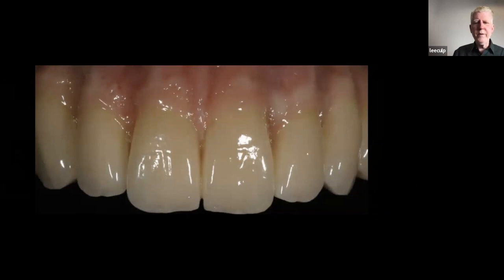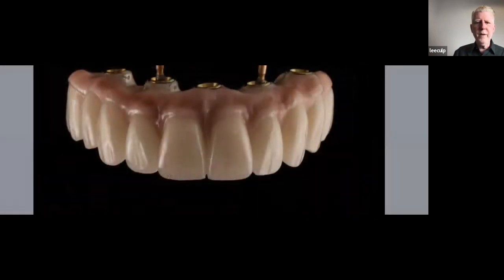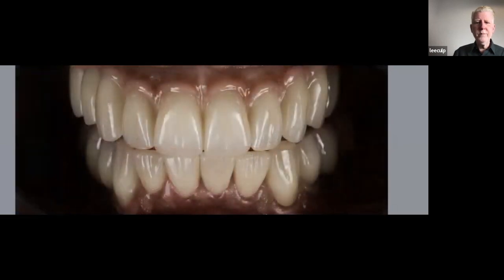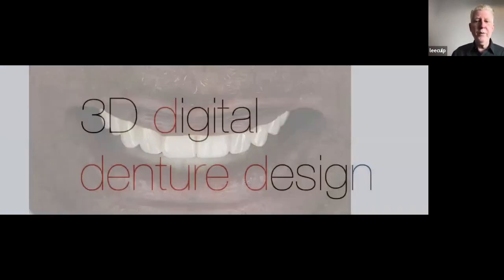So we were able to take everything we've been doing in the ceramic world, because this is all ceramics, and then move it into the PMMA world. All we were doing is creating what we've been creating for years, and just not attaching it to an implant.